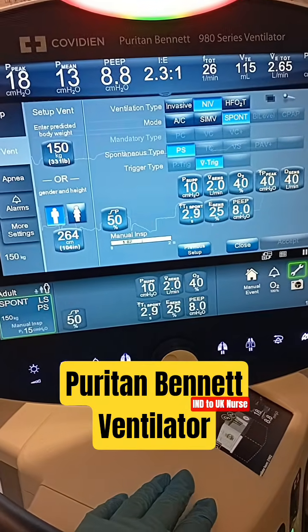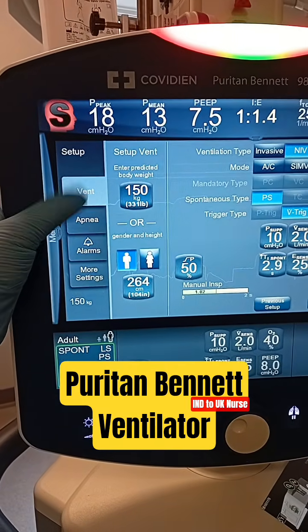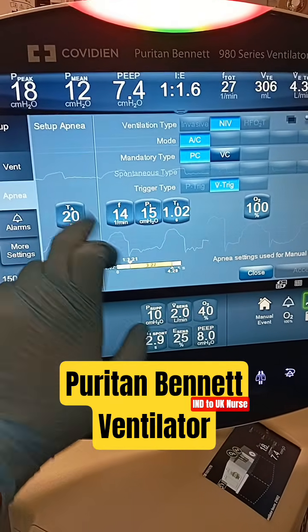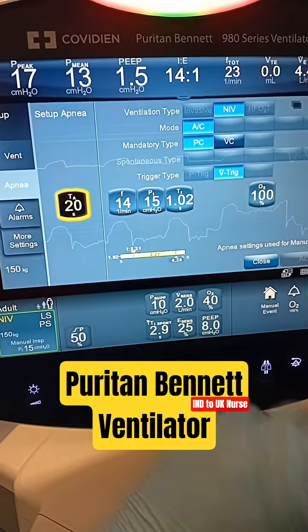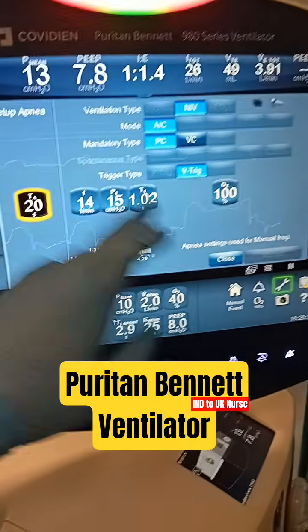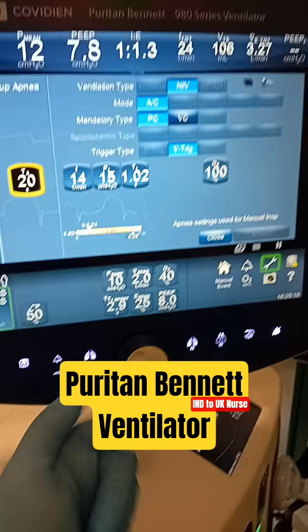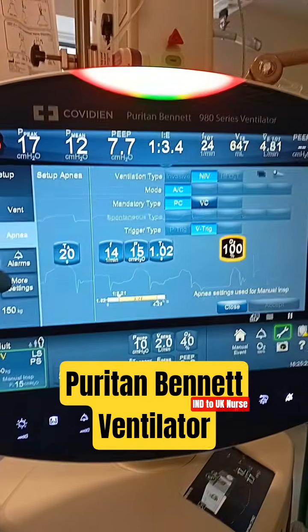Okay, so that is there. And the main things, we have the setup like this, this is with the ventilation, this is the apnea setting. So usually, mostly we will be keeping 20 seconds. If there is 20 seconds and the patient is not taking a proper breath, then immediately the ventilator starts alarming. In case there is hypoxia on the ventilator, that you are seeing the saturations are getting down, then you can give a flush of 100% to the patient.